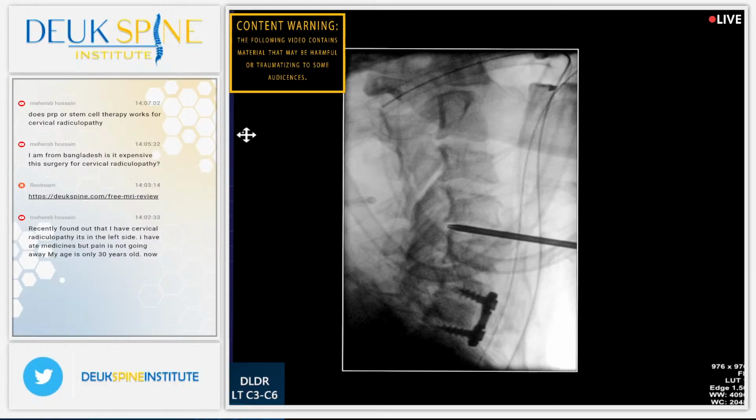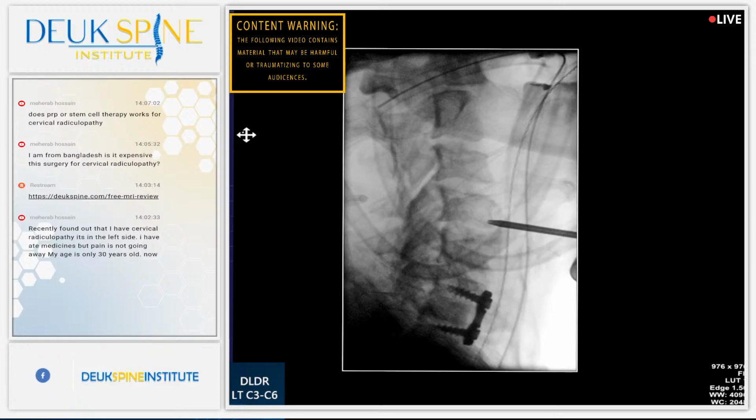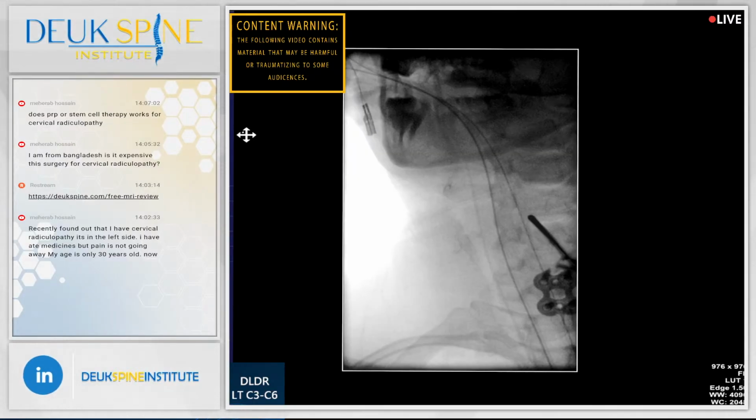Actually, I'm going to come out. Hold on. Shot. Here we come. Out. Outside now. We're outside the disc. Shot. I'm going to move north. I need to know if I'm left or right of the spine. Give me an AP view. Shot. I'm to the right of the spine.